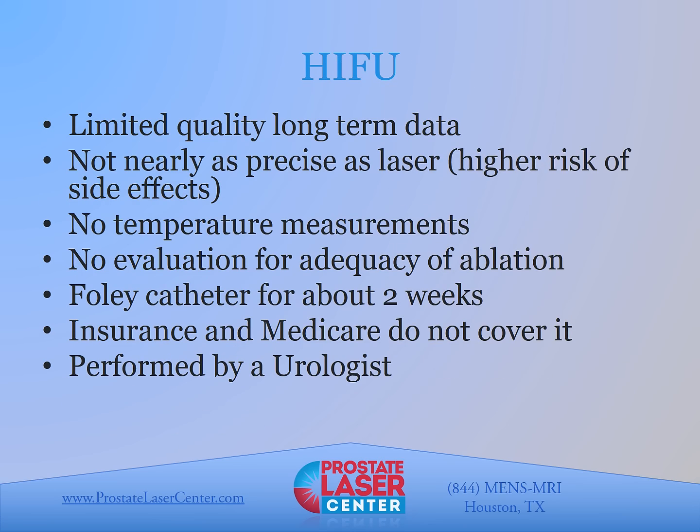High-intensity focused ultrasound, or HIFU, is another emerging technology. This has limited quality long-term data. It's not nearly as precise as laser, which means it does have a higher risk of side effects compared to laser. The vast majority of HIFU practitioners use ultrasound guidance, not MRI, which means that they cannot obtain real-time temperature measurements of the tissue that they're ablating. They can't really evaluate for adequacy of the ablation like an MRI can.